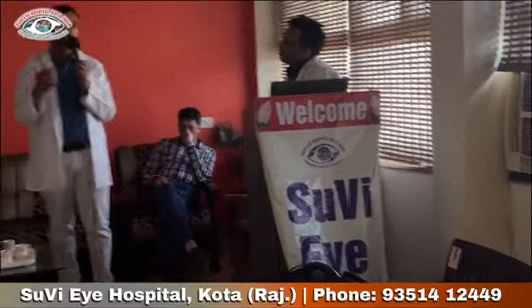But literature-wise, theoretically speaking, there are no studies to state that a prophylactic barrage laser before refractive surgery is related to retinal detachment post refractive surgery. But we do it as a defensive practice.